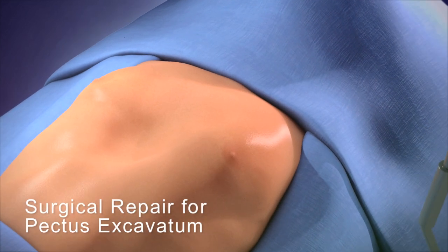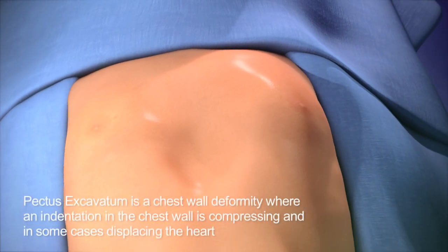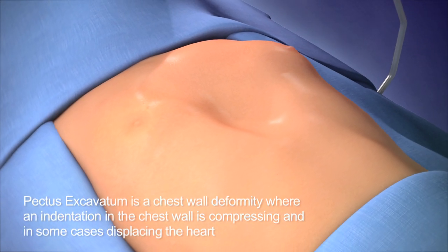In this animation, we see a patient with pectus excavatum. The indentation from this deformity is compressing and in some cases displacing the heart.